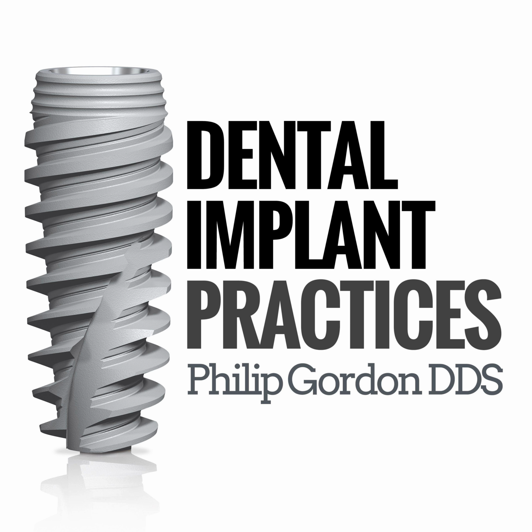You want to avoid over preparation and over widening, so that you can have proper torque when torquing them in. I believe primary stability and insertion torque is one of the main critical factors in the osseointegration of the implant. So making sure that the final drill matches the implant size is important, and do not oversize. A lot of implant companies will have drill sequence charts. It's usually getting to depth with your 1.5 and 2, and then widening up until the last implant size, and then torquing in your implant with or without a screw tap, depending on the upper or lower.